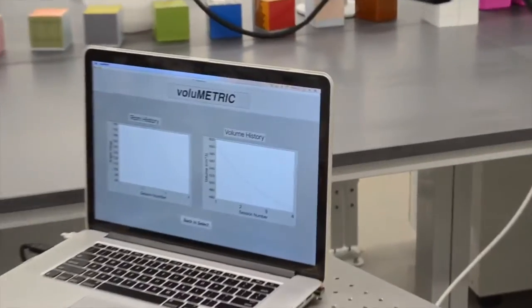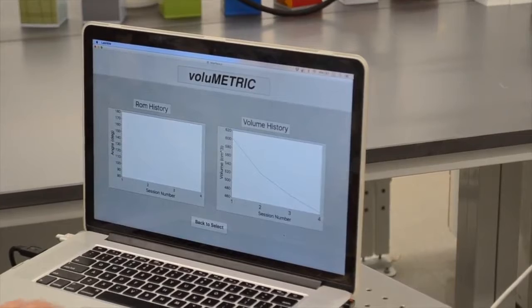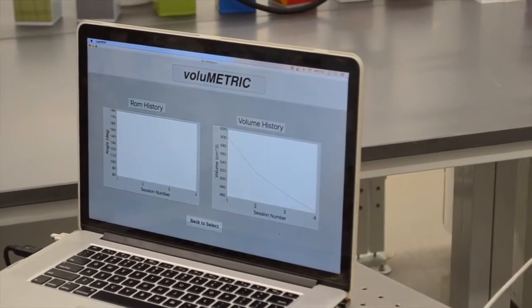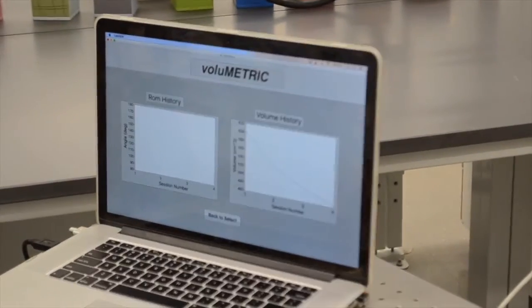So as you can see, Kelly started out with a very swollen hand in her first session with the system, and over time she's gradually improved as she's gone through her PT process, or in other cases maybe she didn't do as well and it could have gone up.